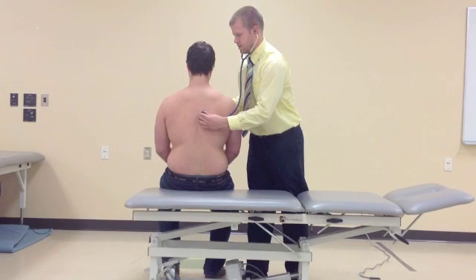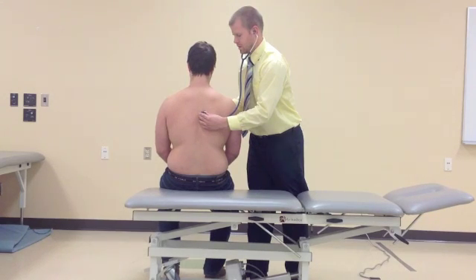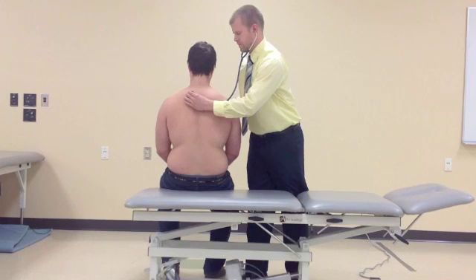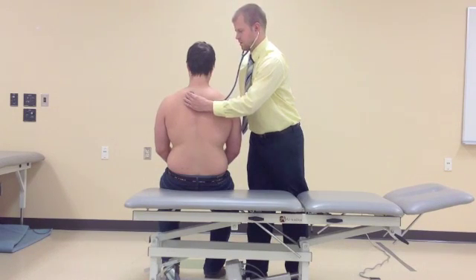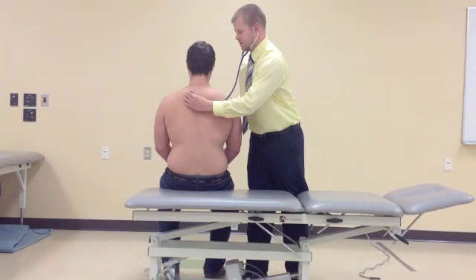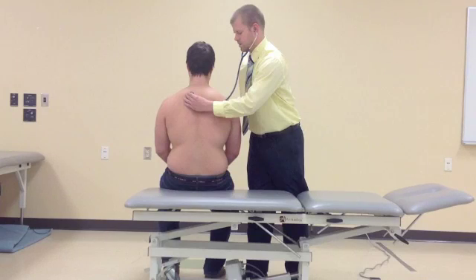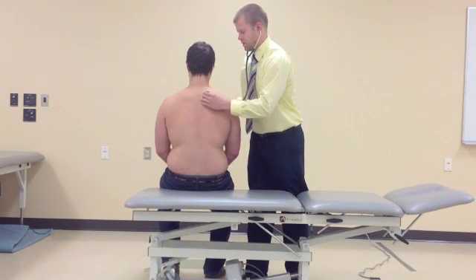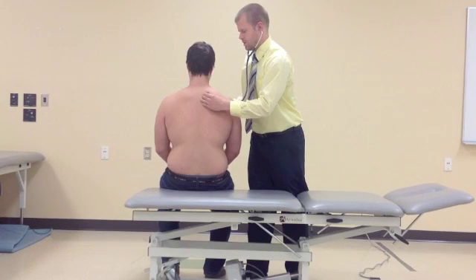The next sound is a normal tracheobronchial breath sound, found close to the midline of the back. Tracheobronchial sounds are loud and high pitched with expiration being slightly louder and longer, with a pause between inspiration and expiration.